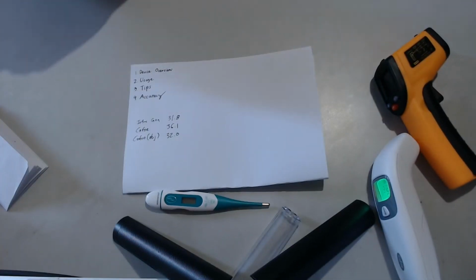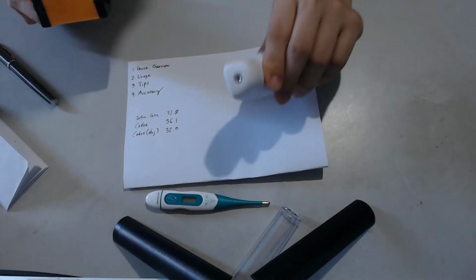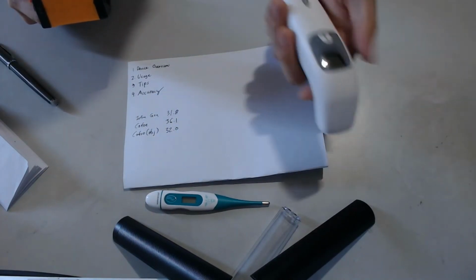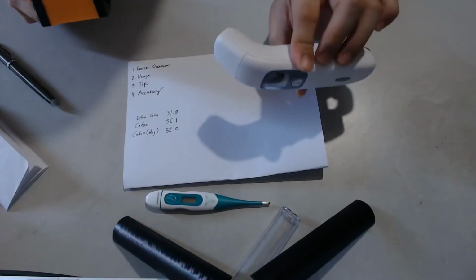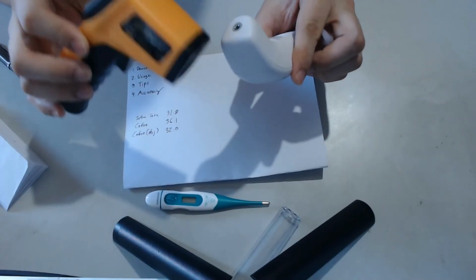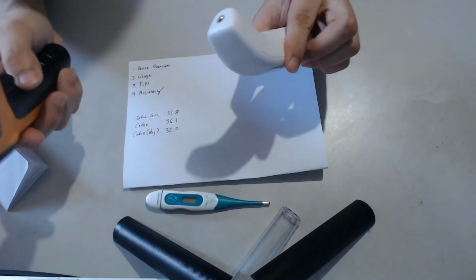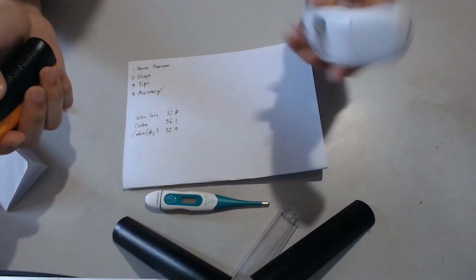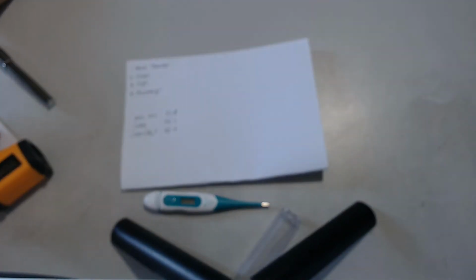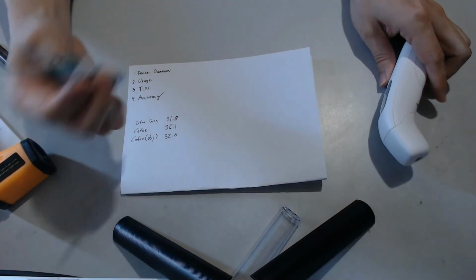So this is not the most scientific experiment, but the external body temperature is not equal to the internal body temperature. And the reason why this device works better than this is because, when used in accordance with the manufacturer's instruction, on the forehead and the ear, it's actually calibrated to map the external body temperature to the internal body temperature. What about this?